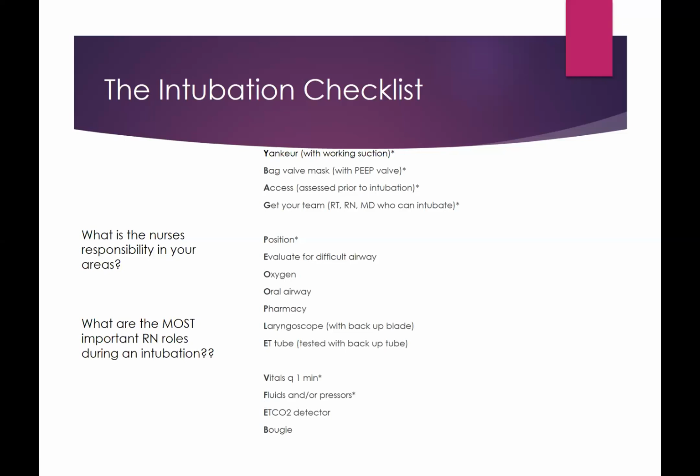If I see their blood pressure starting to fall and this person is a candidate for a fluid bolus, do I have that easily accessible? Or do I have somebody who can go and get me that if it's something that I need? What I don't want to do is leave the respiratory therapist and the physician in the room with no one to watch the monitor while they're trying to intubate to go get a bag of fluids. That's typically not a good scenario for anybody to be in.